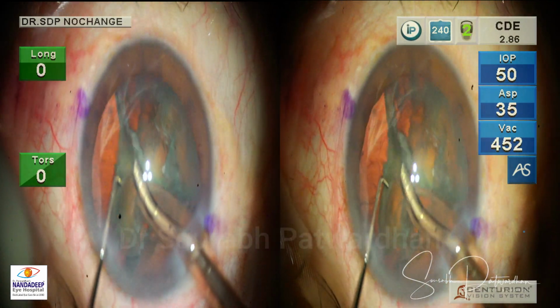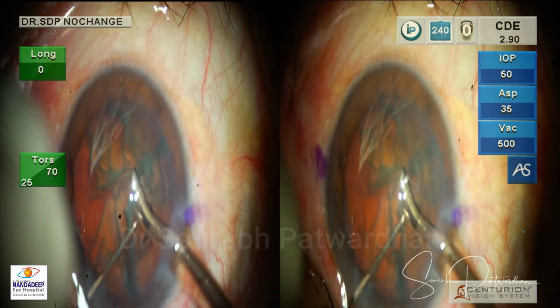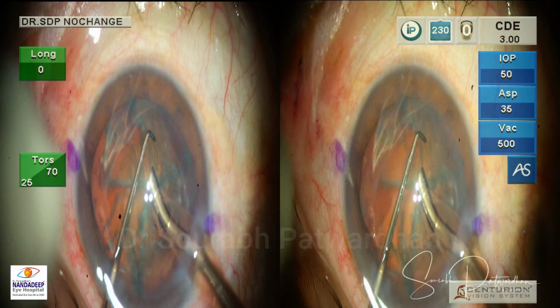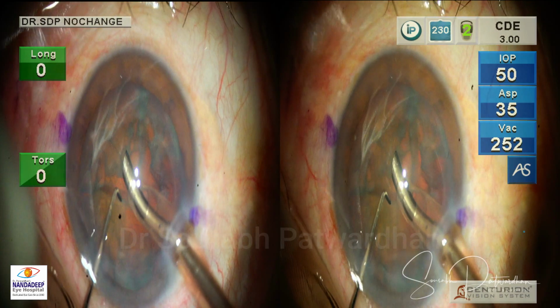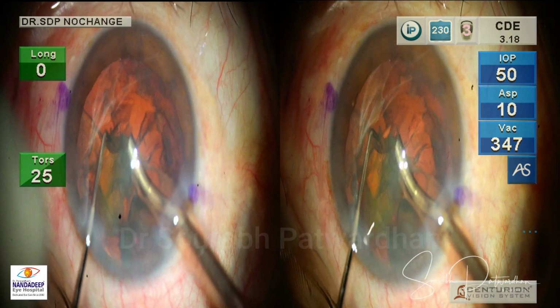So you can see I have kept my bevel sideways. Just let me know about focusing, is it focused? Yeah, okay, it's focused well. So just keep it sideways, and because it is soft, hardly any energy is required.